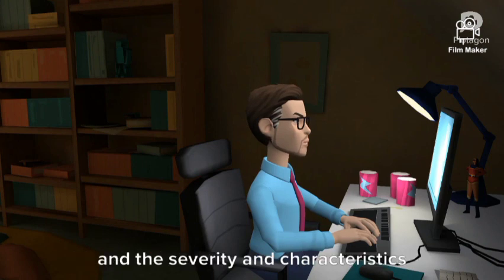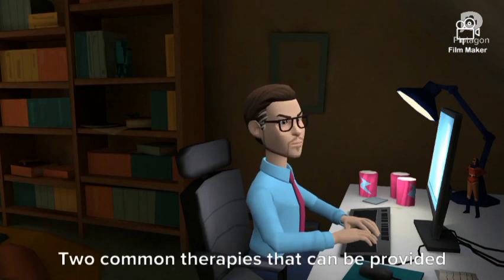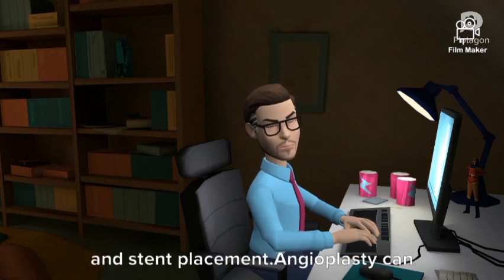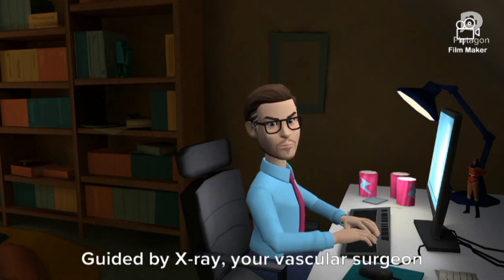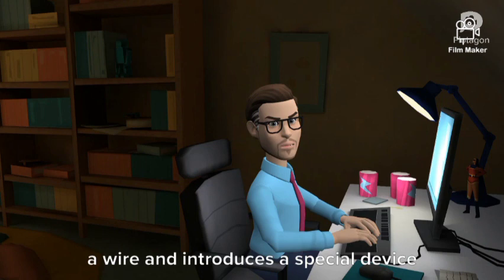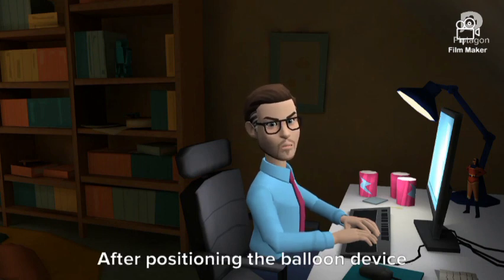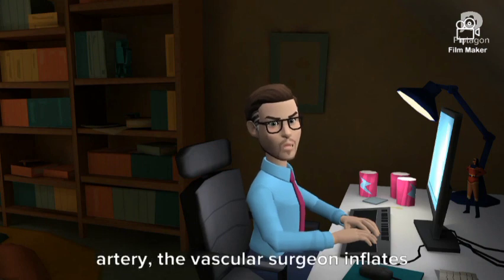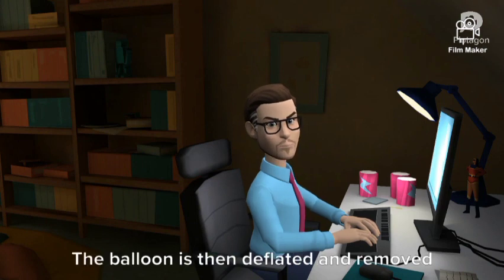This decision depends on your symptoms and the severity and characteristics of the blockages. Two common therapies that can be provided during the angiogram are balloon angioplasty and stent placement. Angioplasty can be used to open arterial blockages. Guided by x-ray, your vascular surgeon navigates through the blockage with a wire and introduces a special device equipped with an inflatable balloon. After positioning the balloon device across the blocked portion of the artery, the vascular surgeon inflates the balloon to expand the artery and compress the blockage.